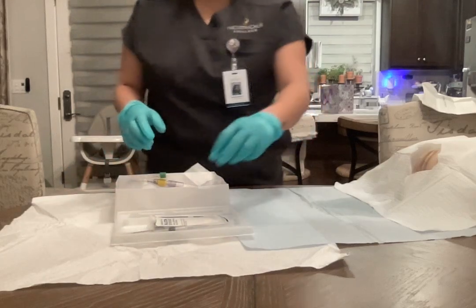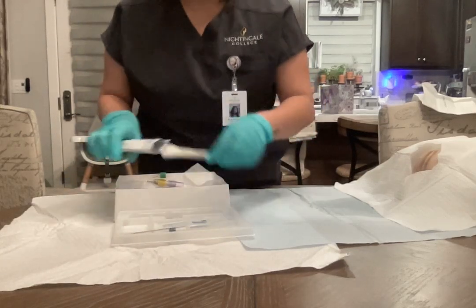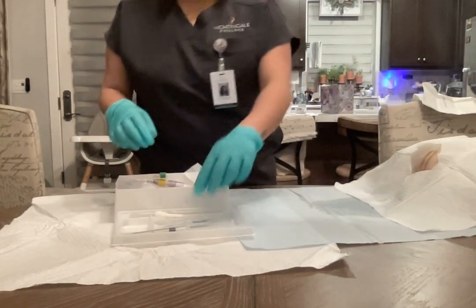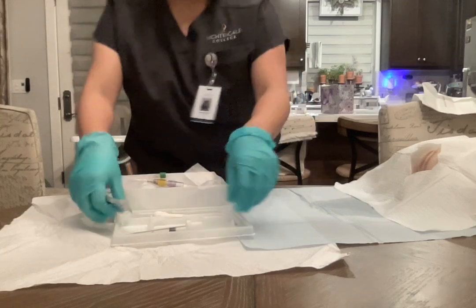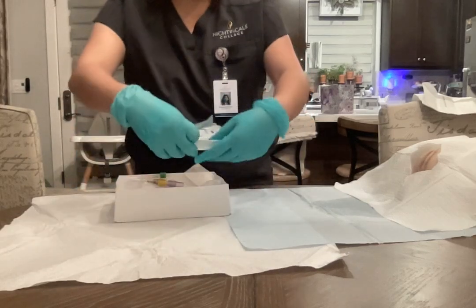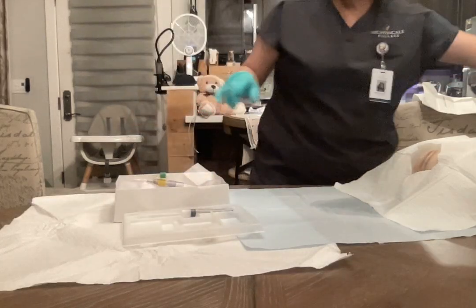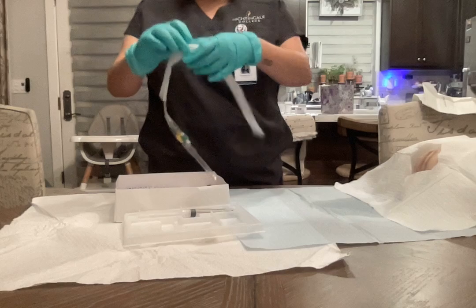Okay, I'm gonna pull out my alcohol swabs and place them in easy reach. I'm going to pretend to open the lubricant. Okay, I'm gonna pull out our Foley and lube the tip.